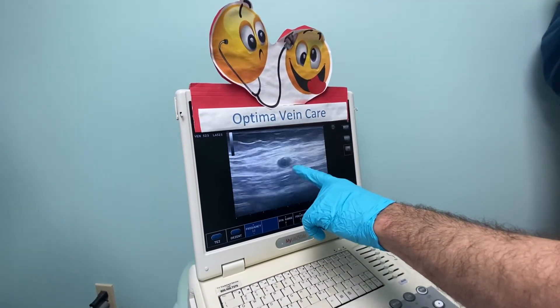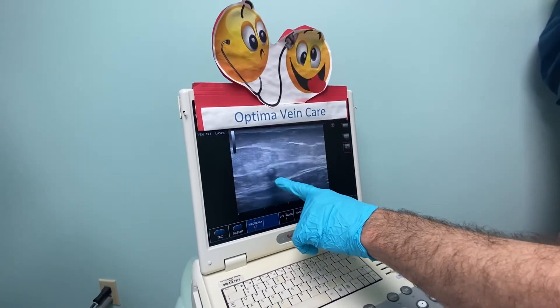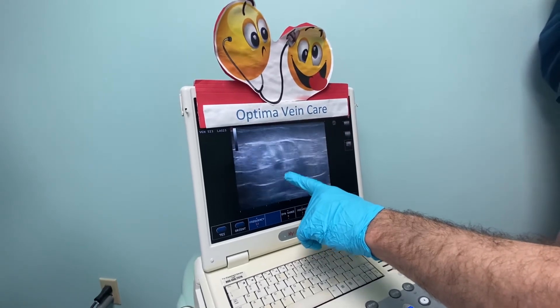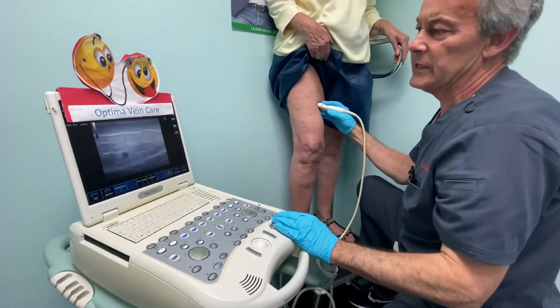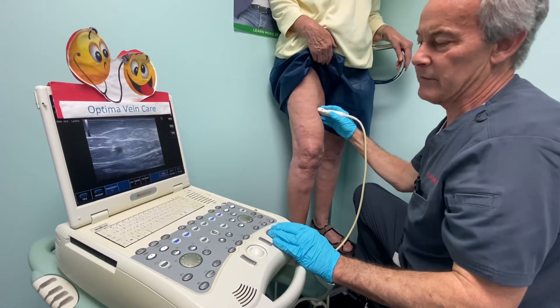This patient's vein came out of the saphenous compartment at the mid-thigh, so I stopped right about down here at the mid-thigh, where you can see the vein kind of comes up. Basically, you don't want to get any glue outside of that saphenous sheet. So the perfect procedure — no blood clots, easy procedure, and should make everybody happy.